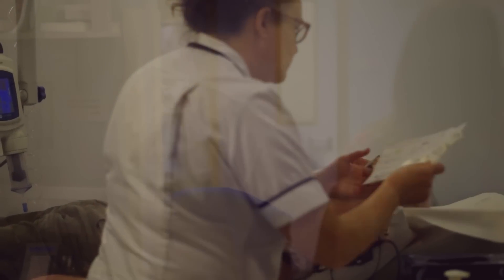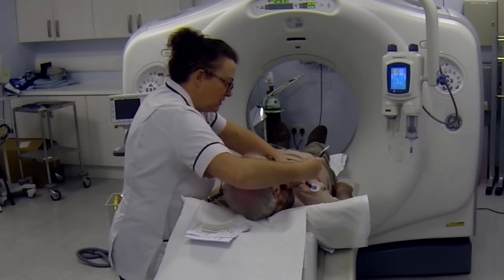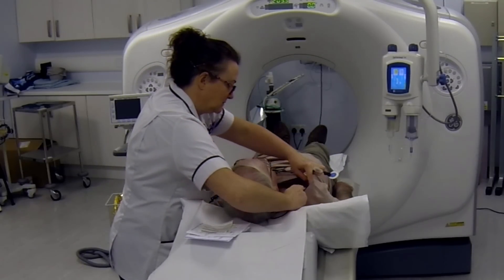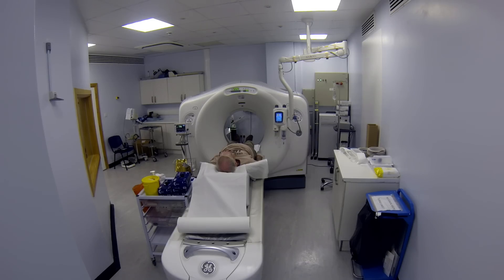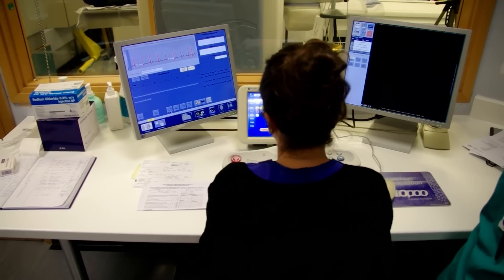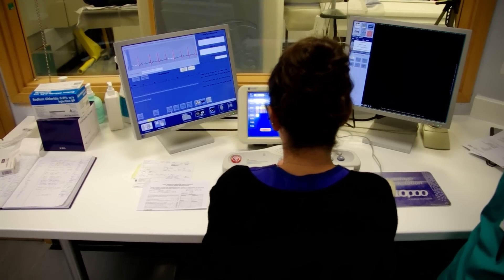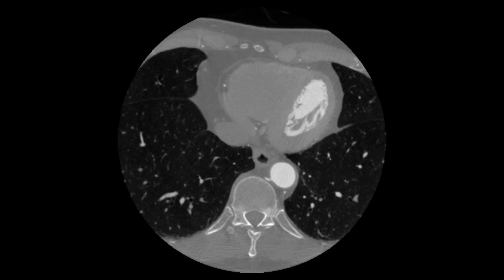Once you come into the scan room, you'll be asked to lie down on the scanner bed. You'll have sticky dots attached to your chest so we can monitor your heartbeat, which is an important part of how the CT scanner works. We'll then ask you to practice holding your breath. As well as seeing how long you can manage, we're also watching what happens to your heart rate.